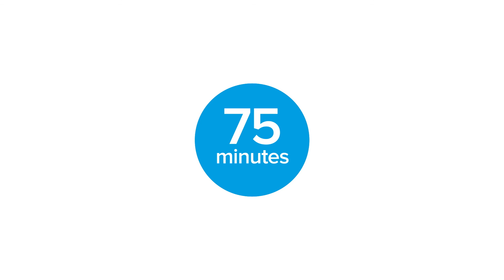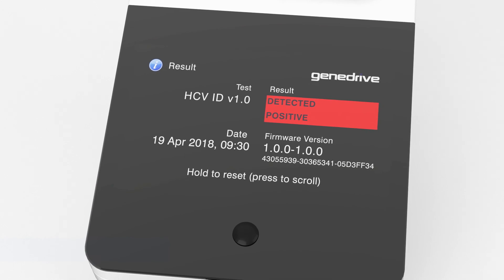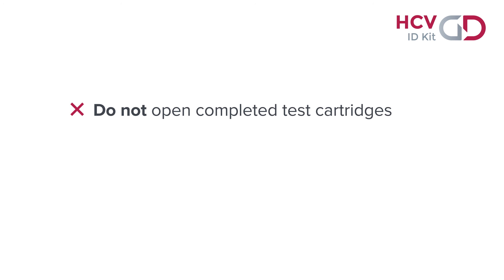Results will be displayed on screen in approximately 75 minutes. An undetected negative result indicates that hepatitis C virus has not been detected. A detected positive result indicates a current HCV infection. After recording the results, remove and dispose of the cartridge as clinical waste material. To avoid environmental contamination with PCR amplicons, do not try and open the cartridge once the test has been completed.